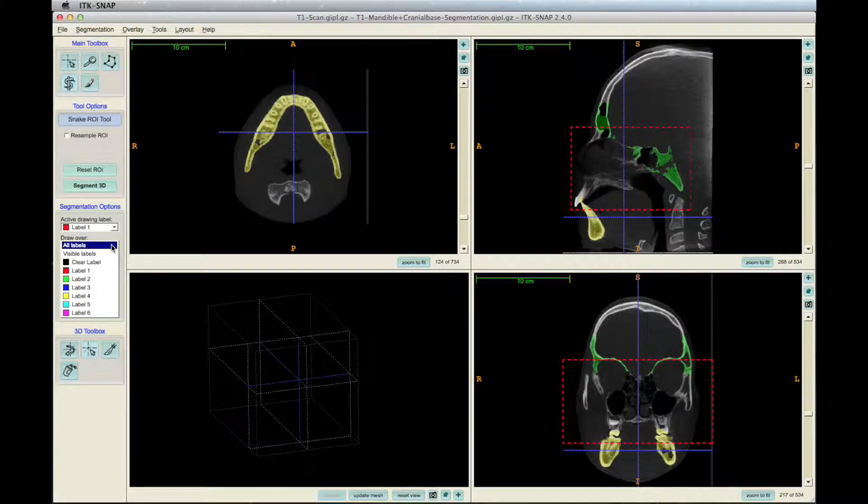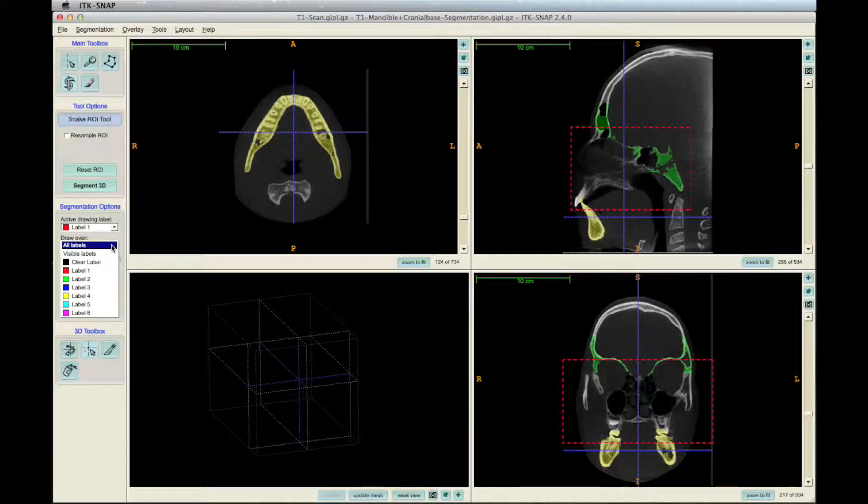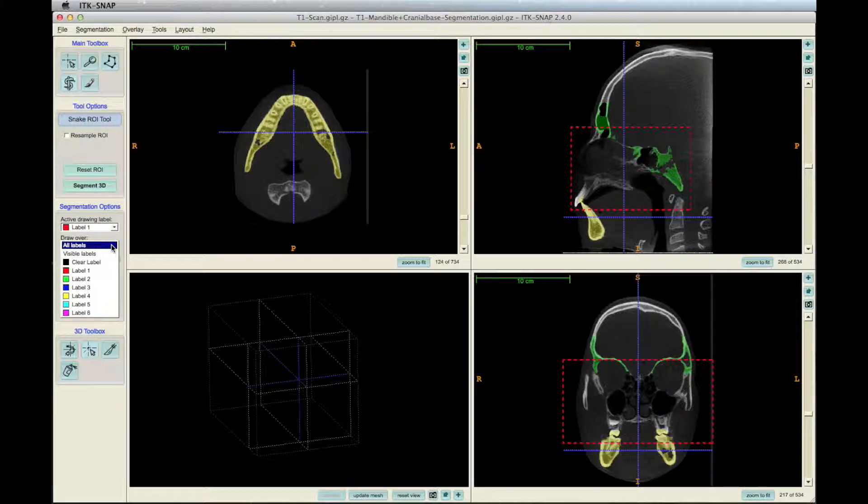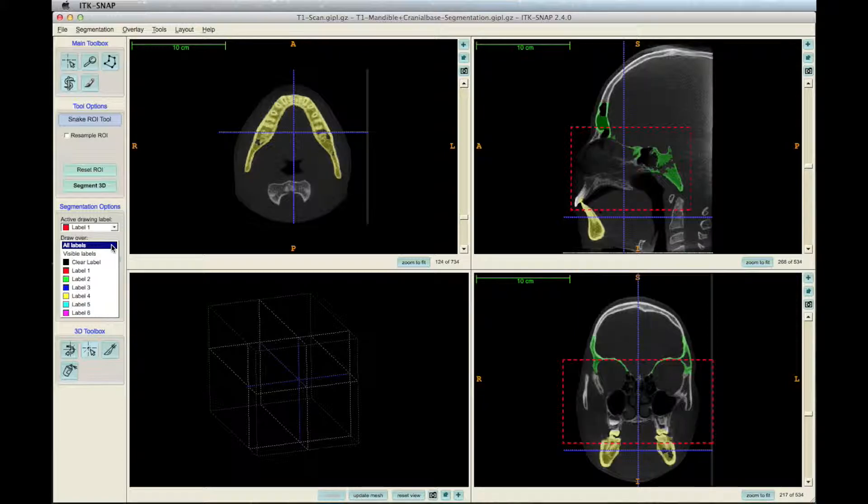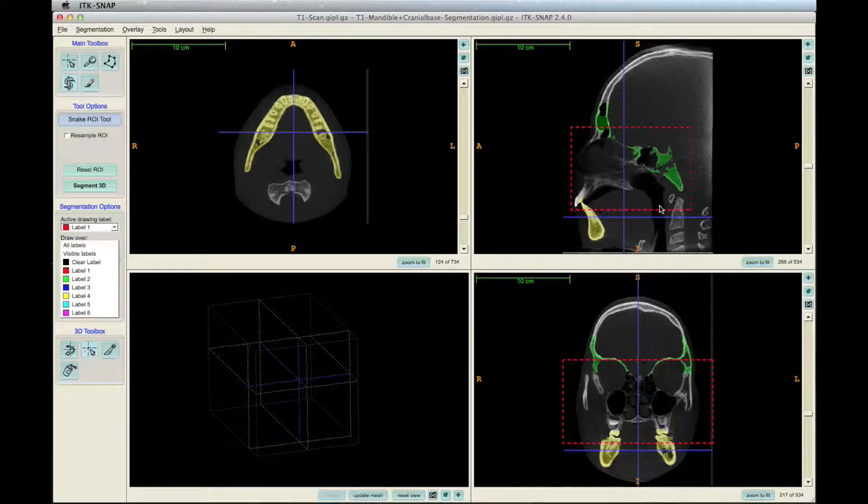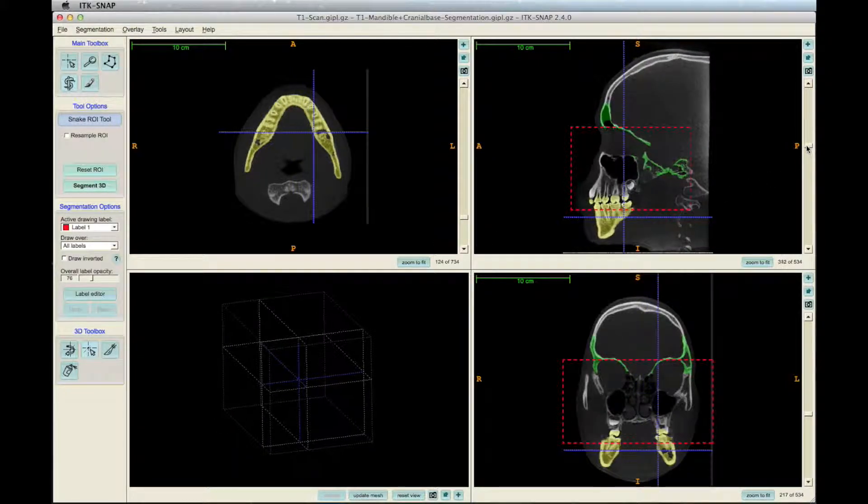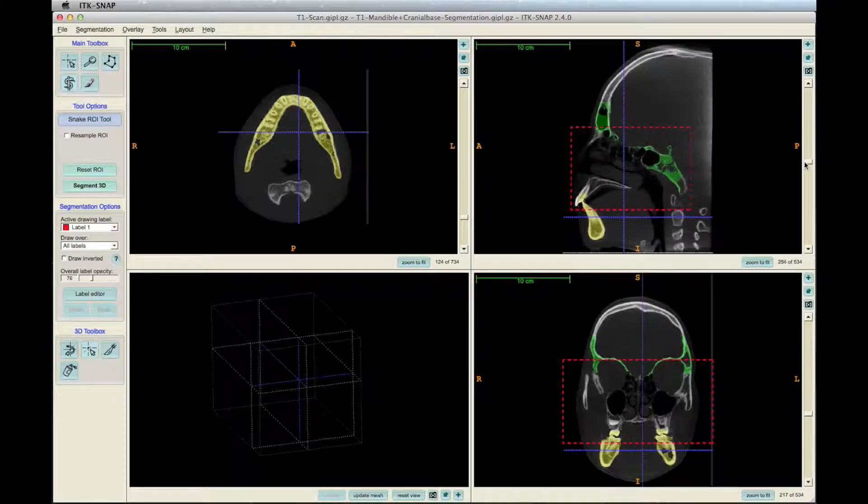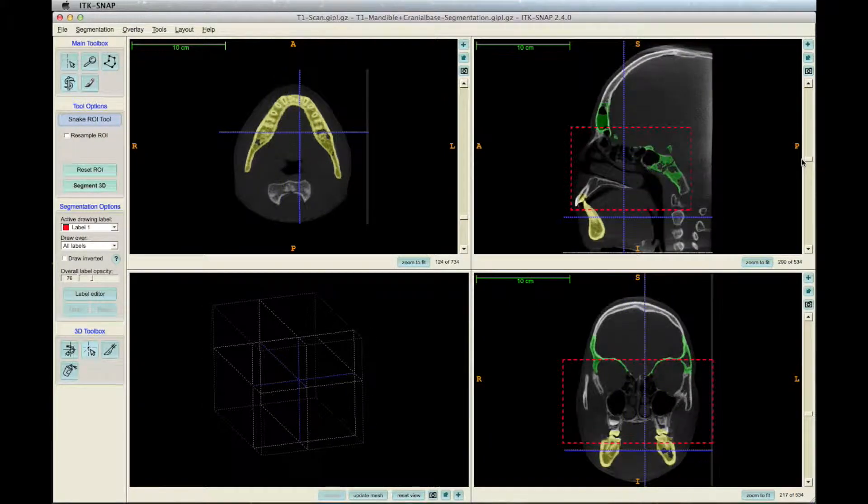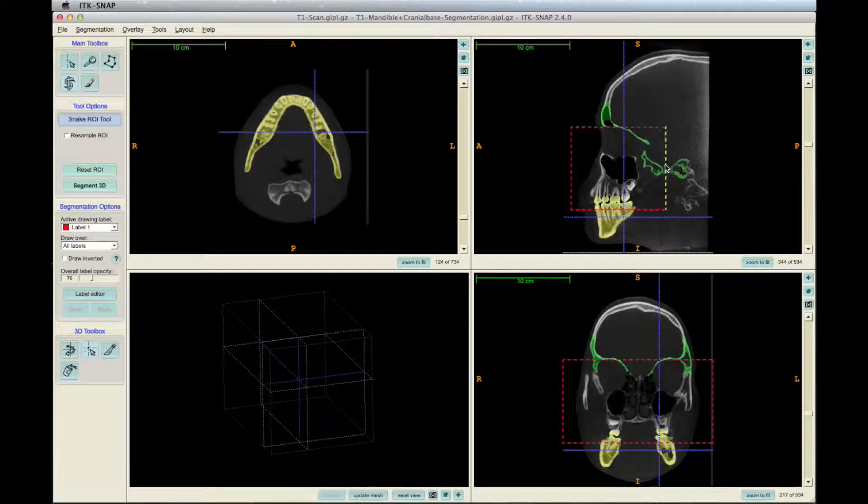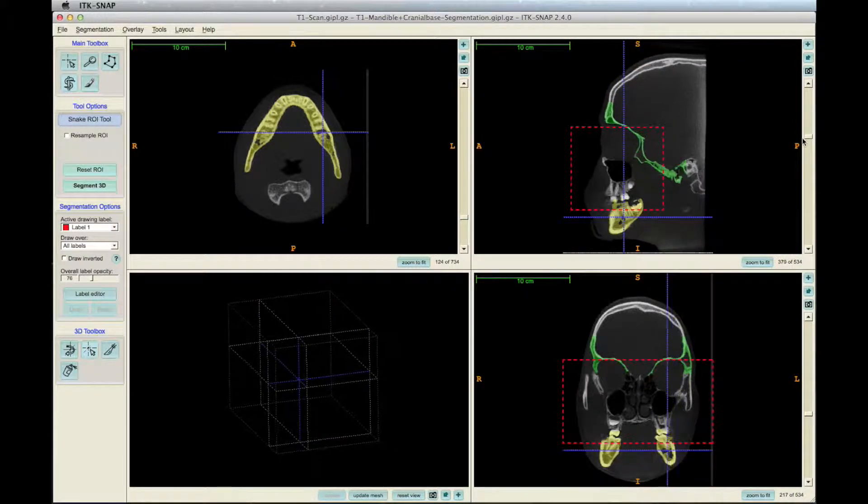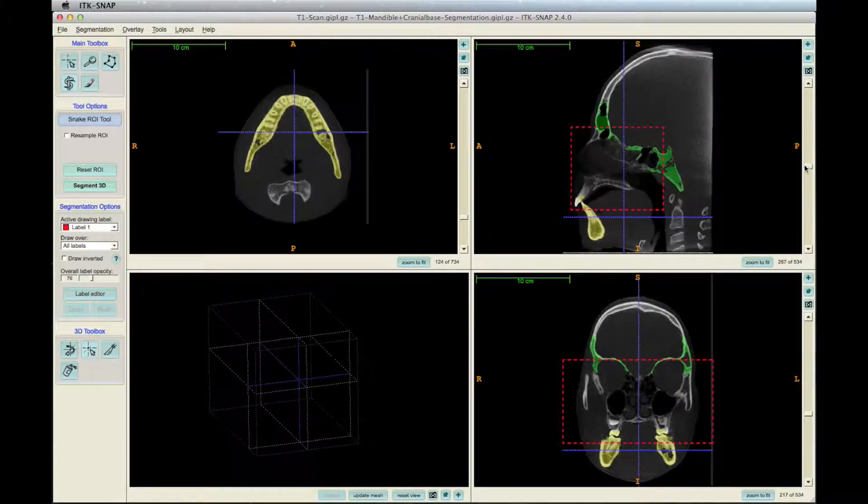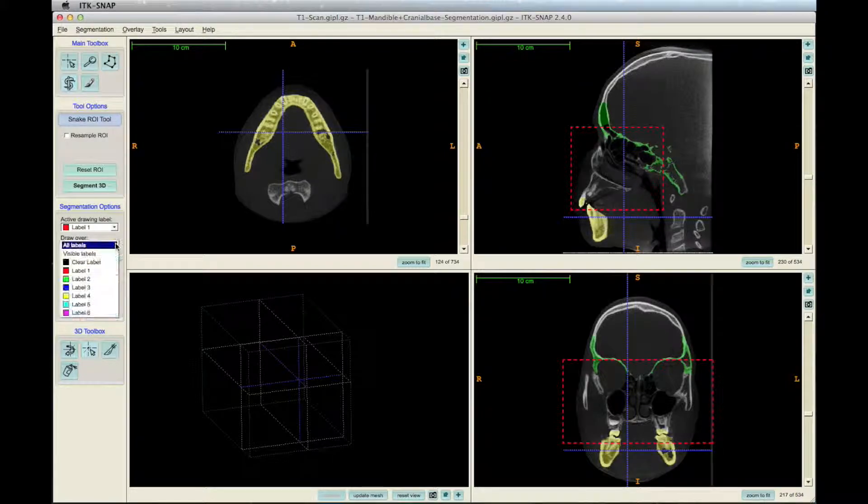In the segmentation options section of the left toolbar, there are two options of colors. The active drawing label is the color that your segmentation will be, and the draw over is where your segmentation will be created. Active drawing label can be any color, and we'll choose red because that's the most common for the maxilla. For draw over, select clear label, since there aren't any other labels yet.